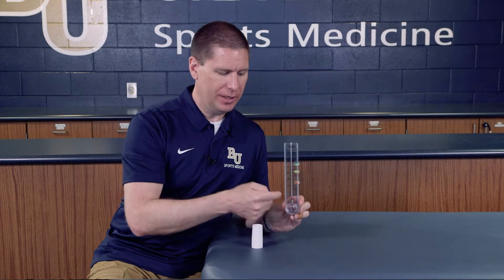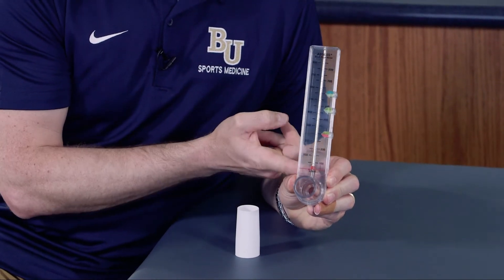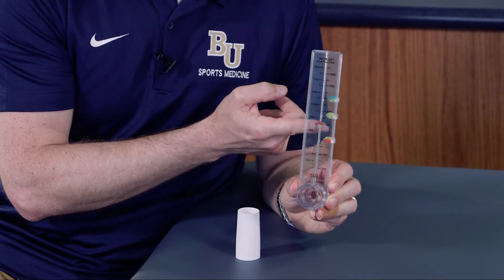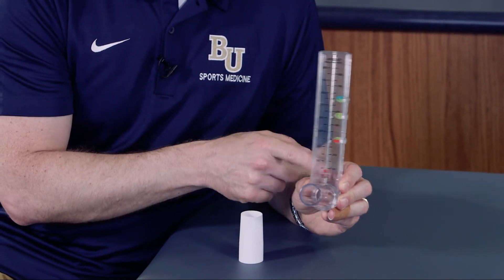Here we have a peak flow meter. What this does is it measures how much air a person can expire from their lungs over a short period of time. You're trying to blow out air maximally, so the air goes into this tube, which raises this red piece up and gives us a reading. This measurement is in liters per minute.